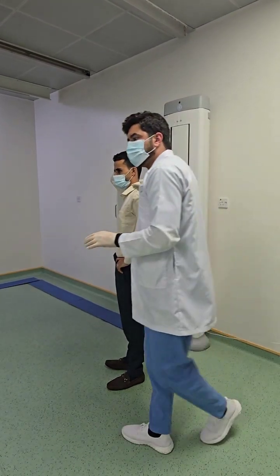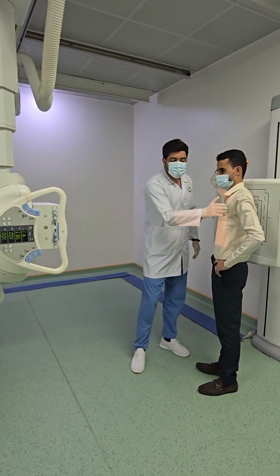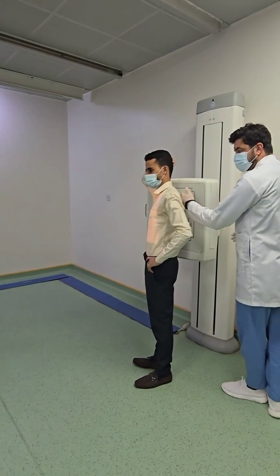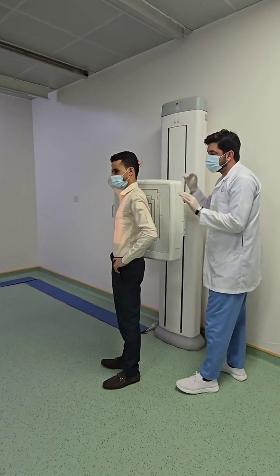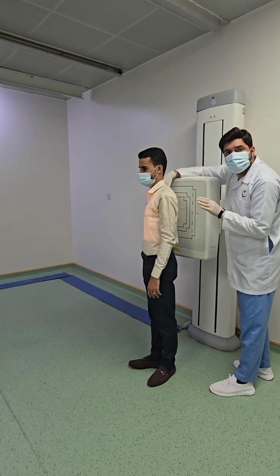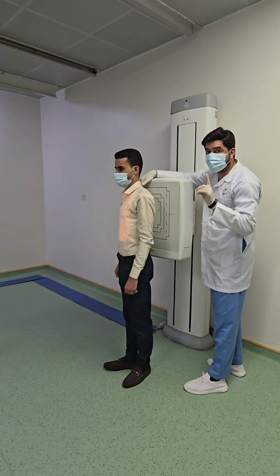In the right posterior oblique position, the X-ray will first interact at the anterior aspect of the body, then will get inside the body and will come out of the posterior aspect of the body and finally will interact with the receptor. But the body is not straight. It is at some angle, that's why we are calling it oblique. This is right posterior oblique position, not right anterior oblique.